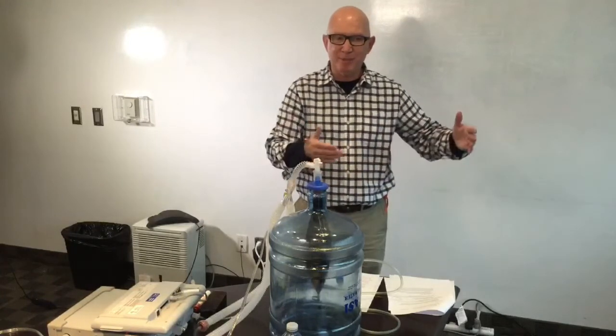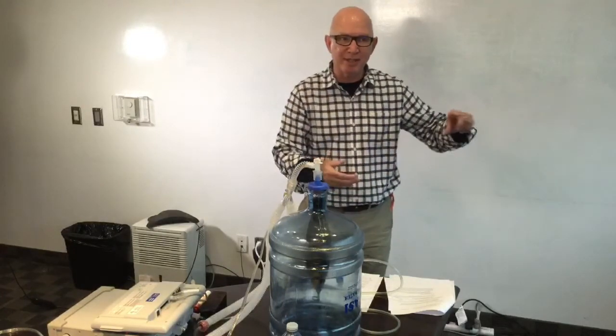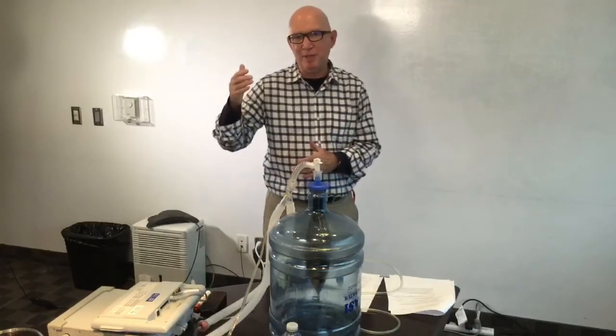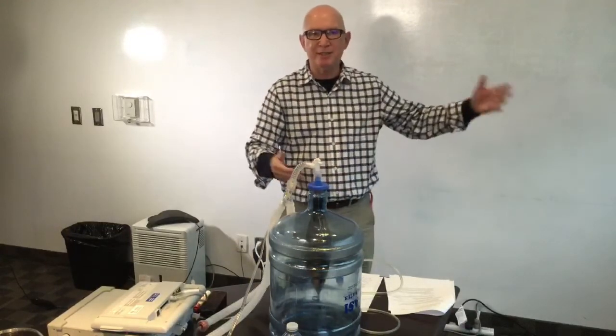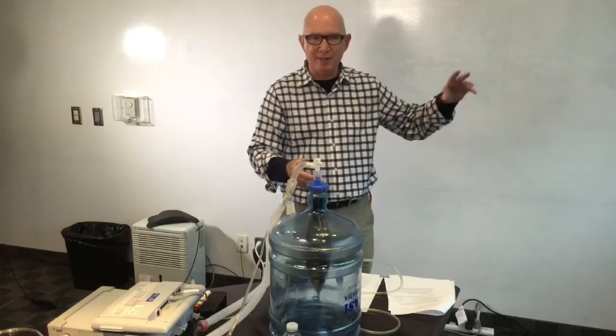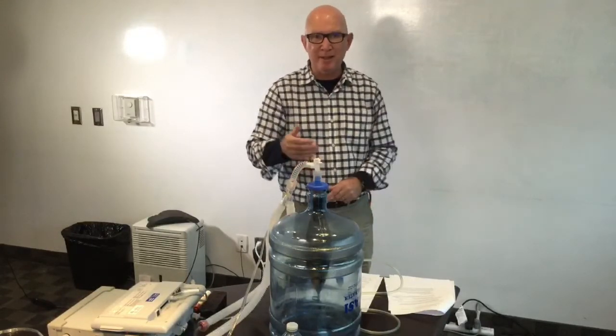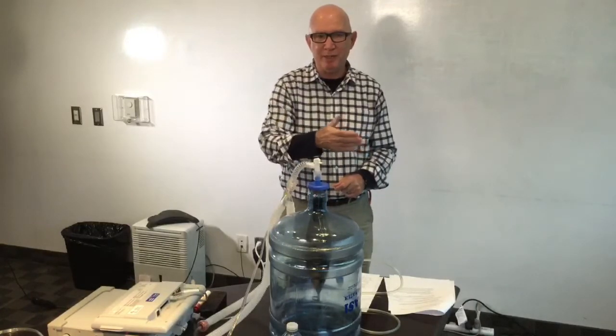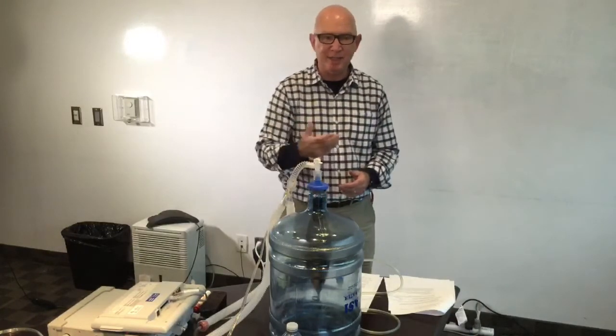So you can just keep reducing these breaths. If it was a surgical patient that had just been on for 24 hours, sometimes you went from 14 breaths per minute right down to 0, or CPAP, let them breathe on that for an hour, see how they do, and then extubate them. If they're on the ventilator for 2 or 3 days, then it was a progressive drop of respiratory rate, which was when the SIMV pace came in.